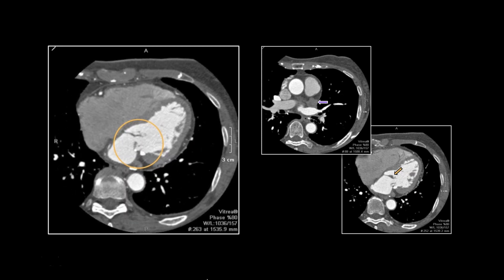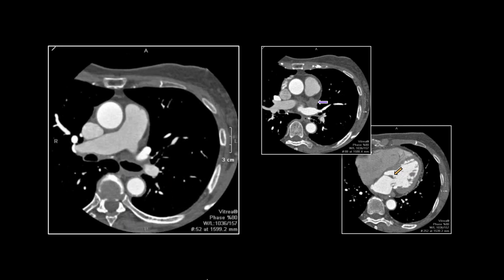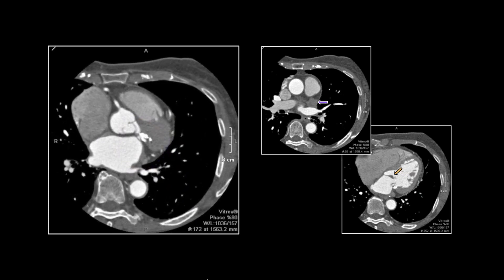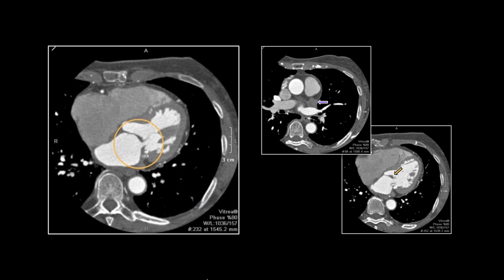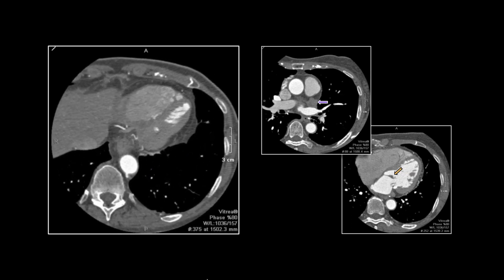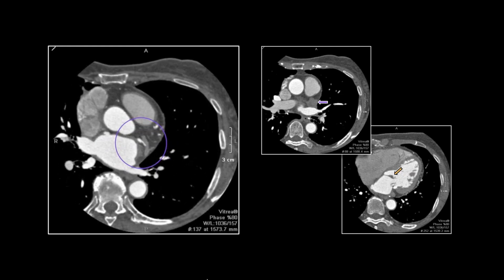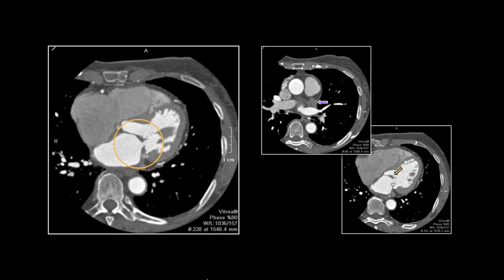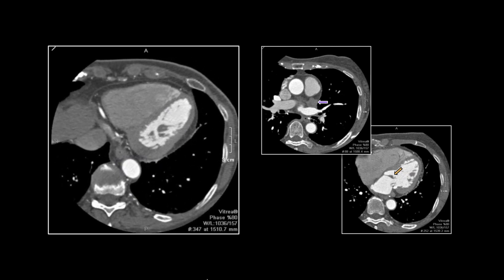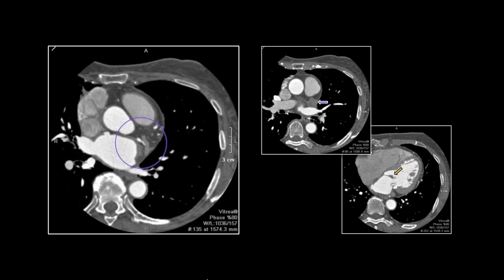Look at that annular calcification and even valve cusp calcification there in the mitral valve. So: thrombosed atrial appendage, annular calcification, and the thickening and irregularity of those valve cusps — it all fits together. You've got stasis, a little bit of left atrial enlargement, but probably stasis in that appendage related to mitral stenosis that ultimately resulted in its thrombosis.